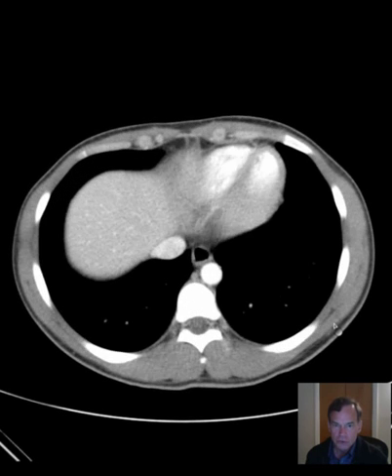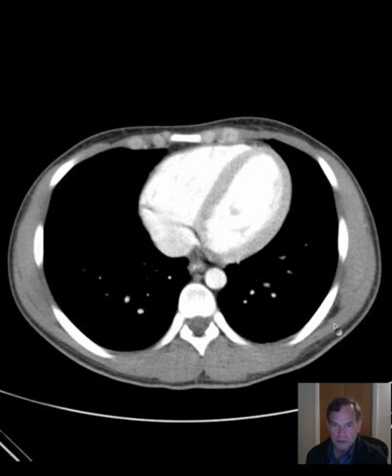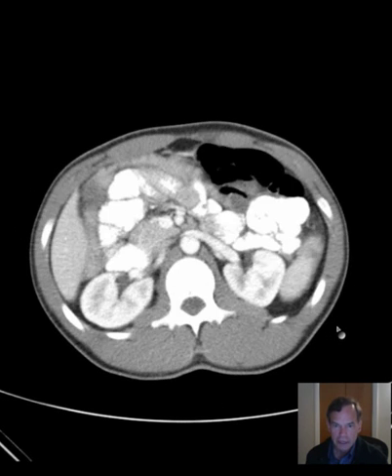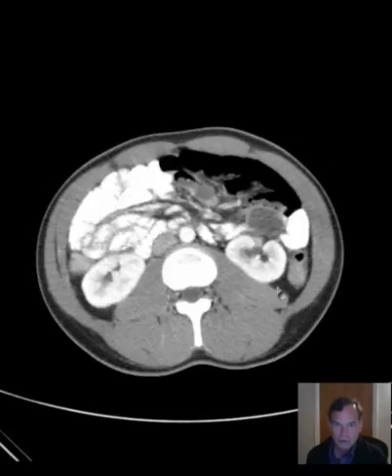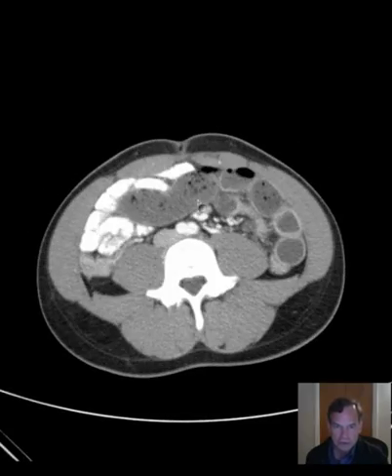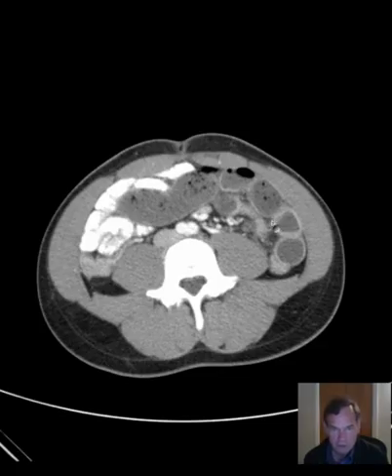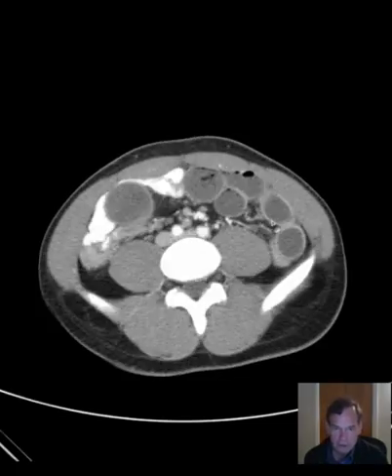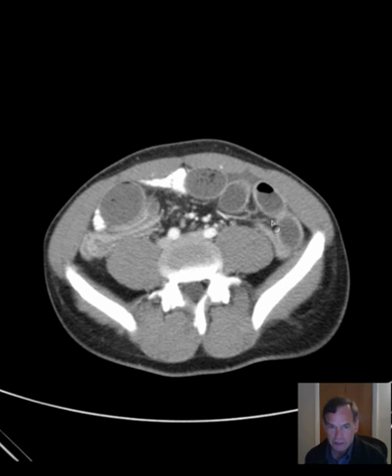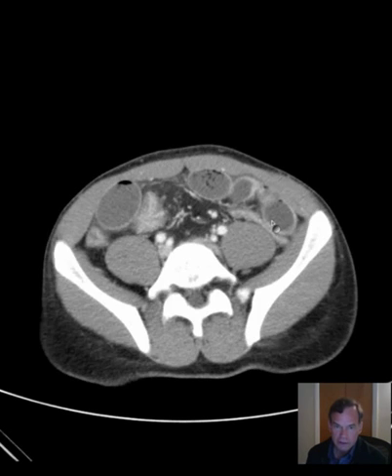So you probably noticed that there is some dilated bowel. We'll have to determine if that's large or small bowel, and where in the large or small bowel it is actually located.